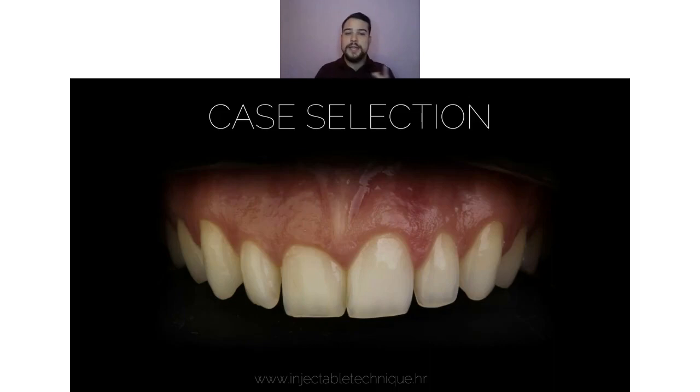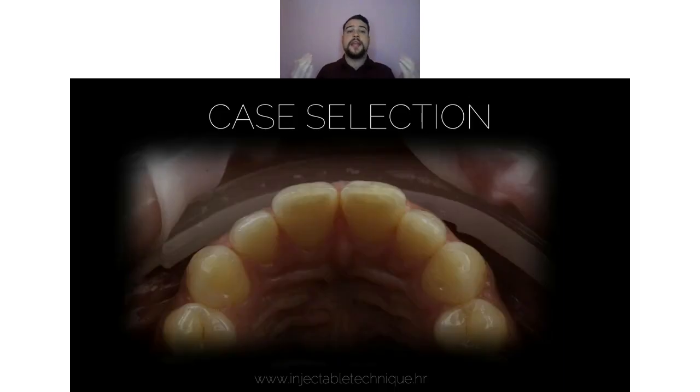You can also use it, in a case of some small misalignment of the teeth, to make a better curvature of the patient's smile line or upper dental arch. In cases of retruded teeth, of course, we can just add some composite to recontour this maxillary arch in a perfect way.